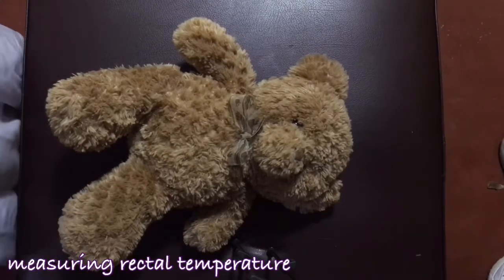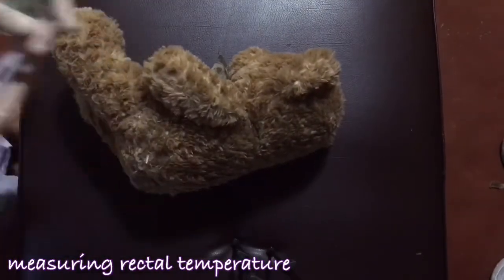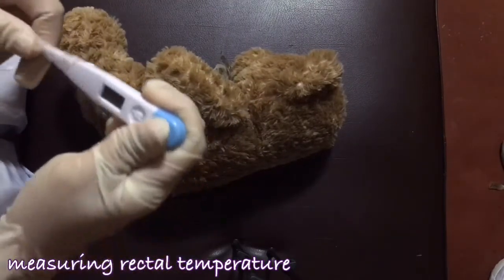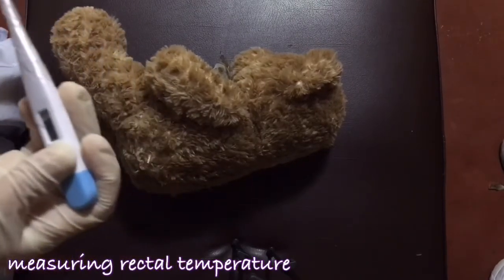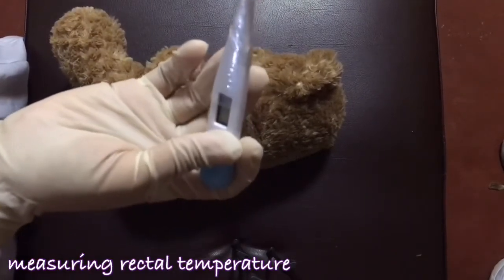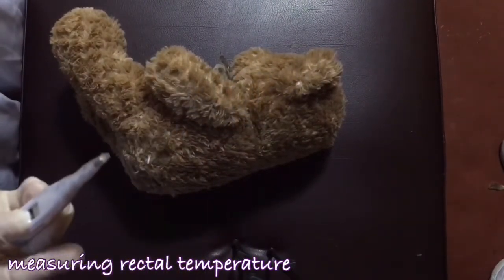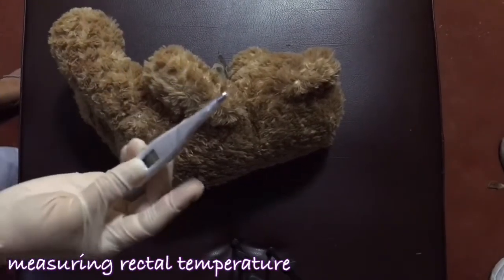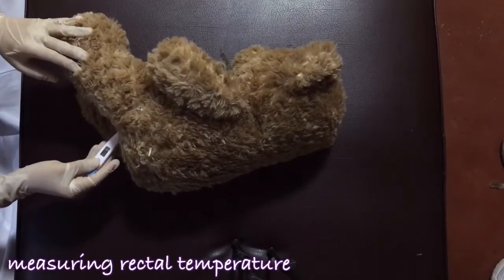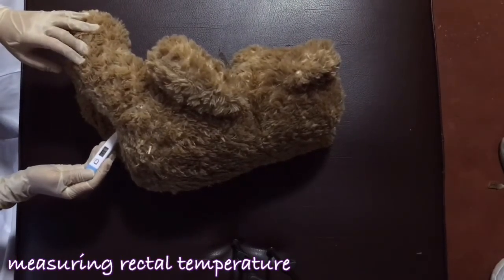I will first turn the client into a lateral position. Then I will put the probe cover on the thermometer and apply lubrication. After the lubrication has been applied, I will now insert it into the patient's rectum for about one inch and wait for one to three minutes or until the thermometer has beeped.